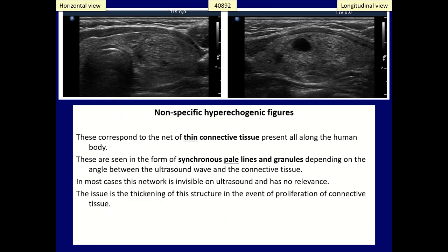In most cases, we do not realize the presence of pale echogenic lines and granules, which correspond to the connective tissue network of the thyroid. Whether the granular or linear form prevails depends on the angle between the ultrasound wave and the connective tissue. This form of intranodular echogenic figures has no clinical or differential diagnostic relevance.